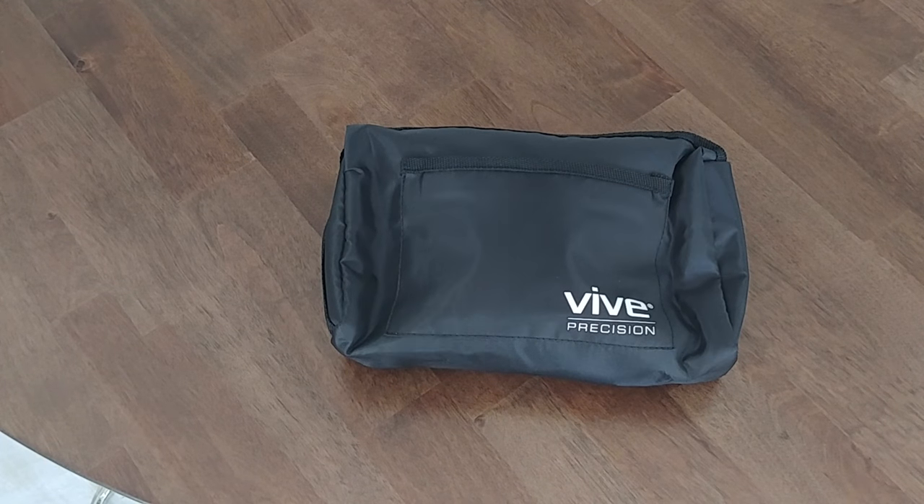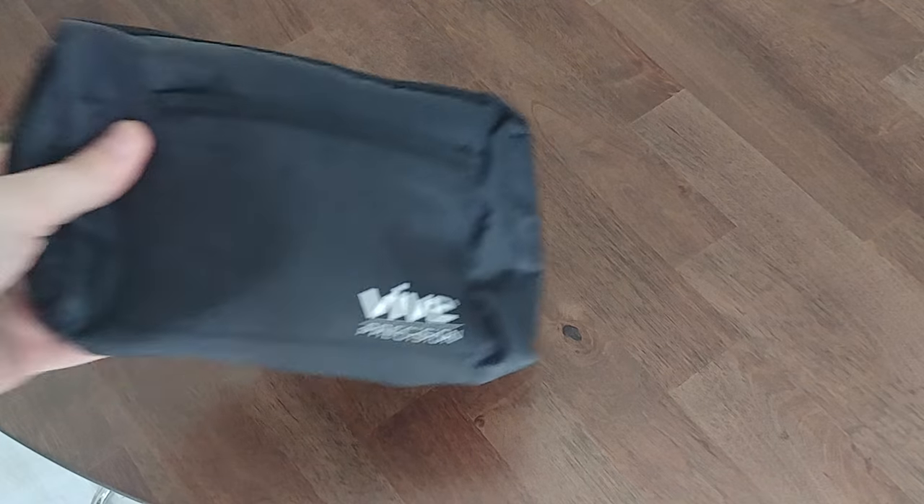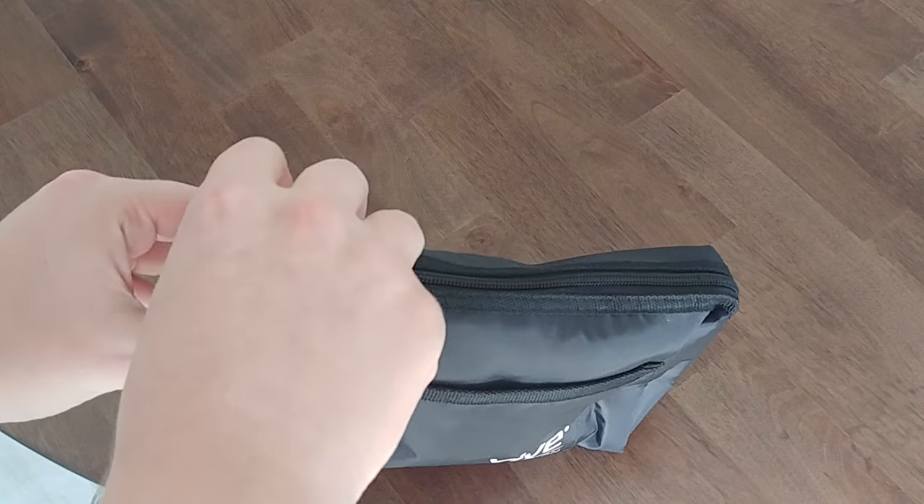I'm going to put together a video on how to calibrate a manual blood pressure cuff, or an aneroid sphygmomanometer. This is the case for our Vive Precision, and here is the device.